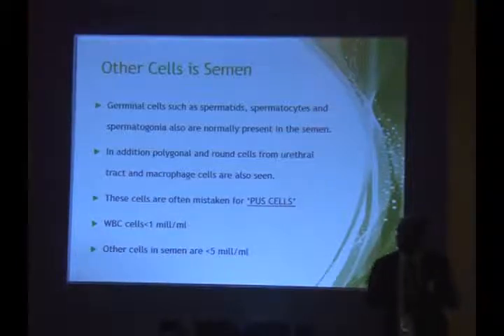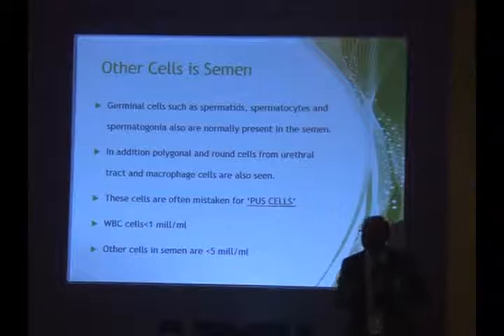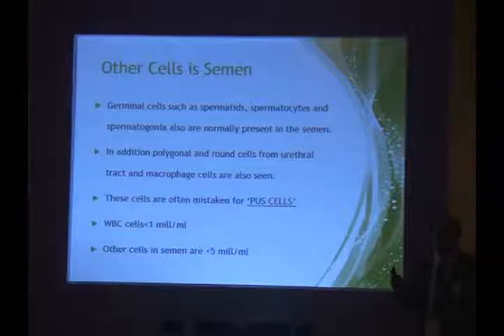So somebody reports 25 to 30, because pathologists are mentally used to judging it in the same context as the urine sample that you see commonly. No, you don't commonly see pus cells in semen. The reason you report it is because you wrongly identify pus cells and immature cells, you are unable to differentiate, but we will all learn to differentiate them. Now we have clarified why each cell is so important when you report.